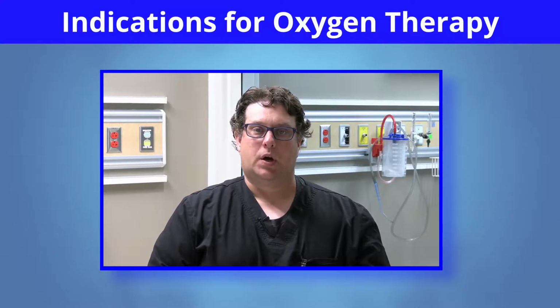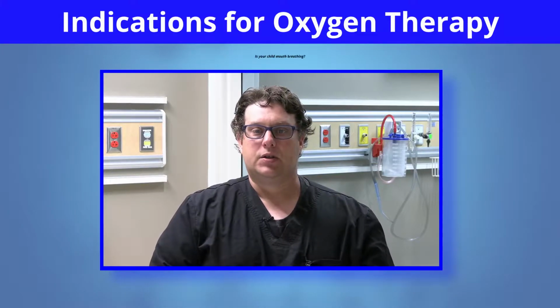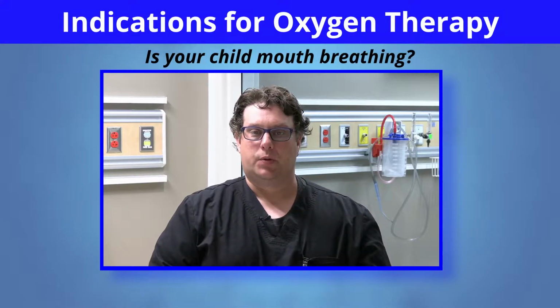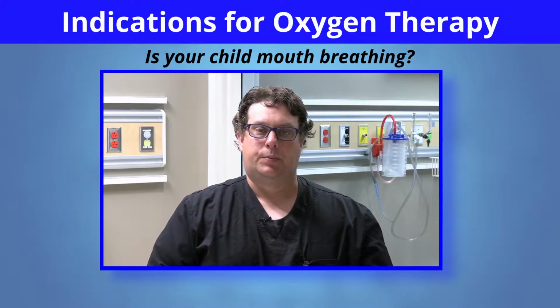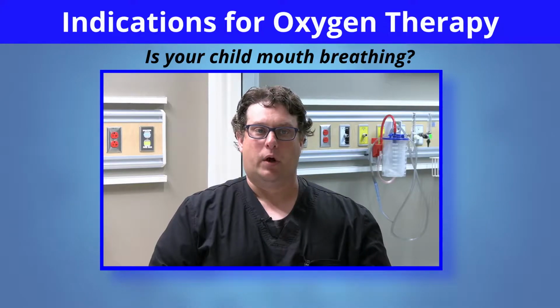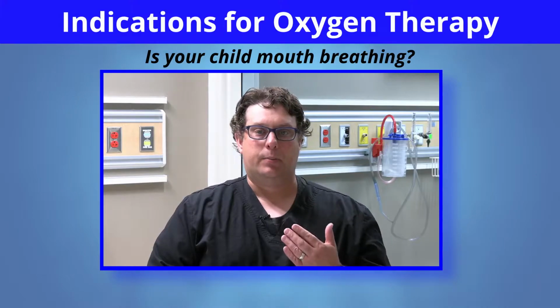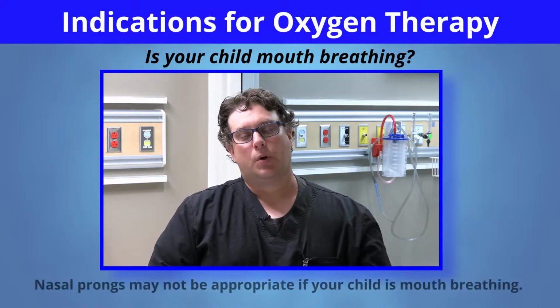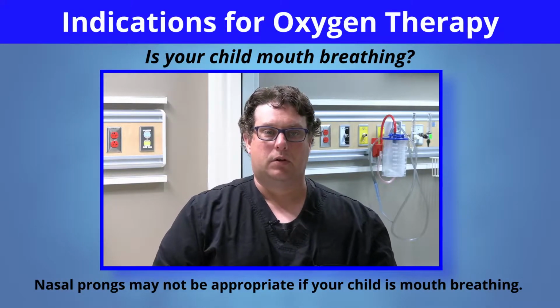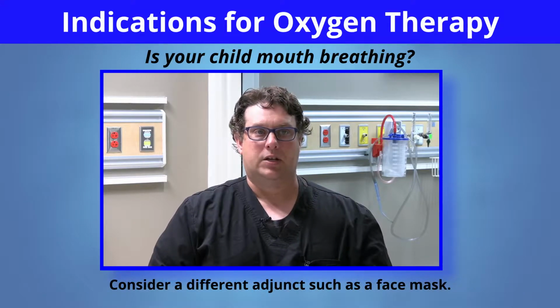One of the things when we're talking about nasal prongs to be worried about or concerned about is, is your child breathing through their mouth? Infants are typically obligate nose breathers, so nasal prongs will work really, really well for them. Children who are a little bit older may be breathing through their mouth, so nasal prongs might not be the appropriate level of therapy, so you may have to consider a different adjunct for that.